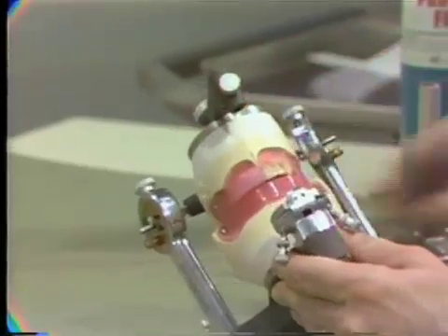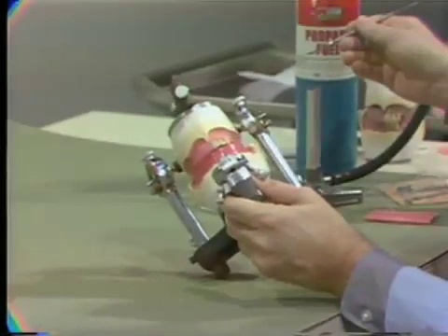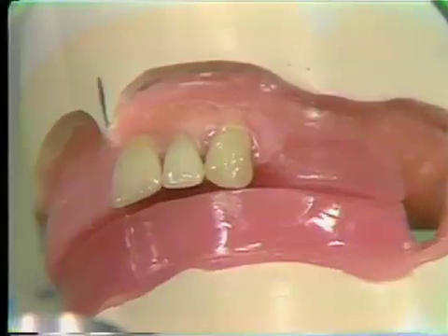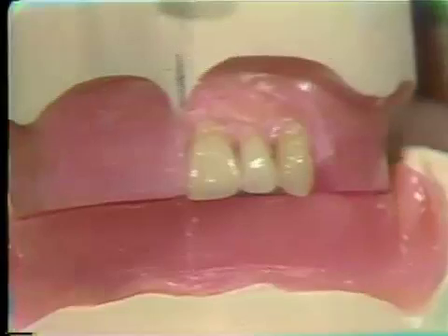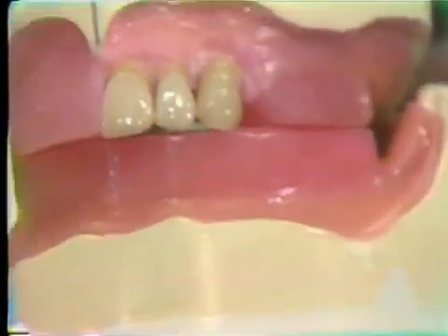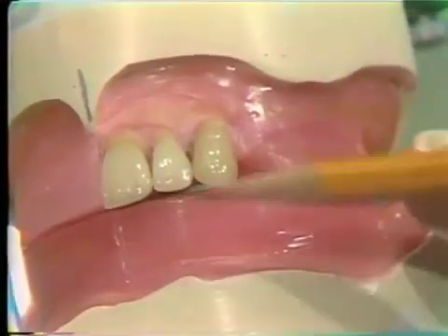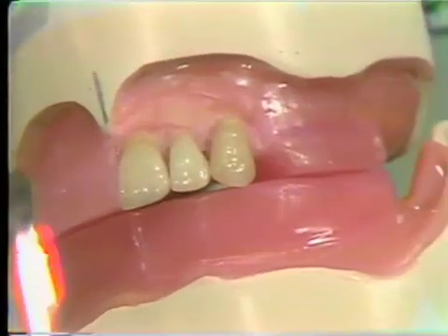Now once again, so we don't lose the tooth, simply put a little bit of warm wax around the neck of the tooth, keeping the wax off the surfaces of the tooth, the labial surfaces of the tooth. And at this point, that's all the farther we will go in the waxing of the denture. Just enough wax to hold the teeth firmly in place, and that's all. Now this completes the setting of the maxillary 3 anterior teeth. The next step, we will remove a block of wax from the lower, the same method used for the upper, and we shall demonstrate setting the lower anterior teeth.